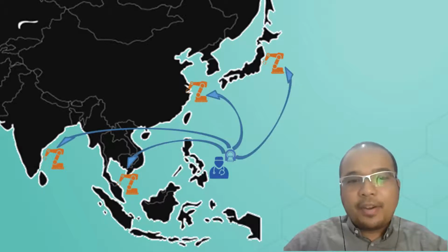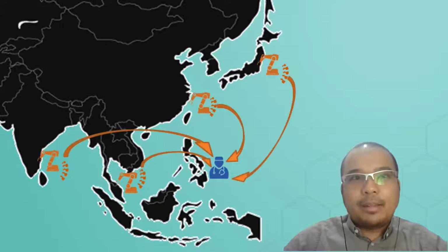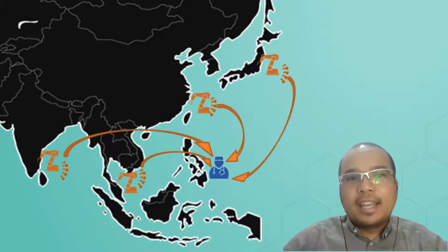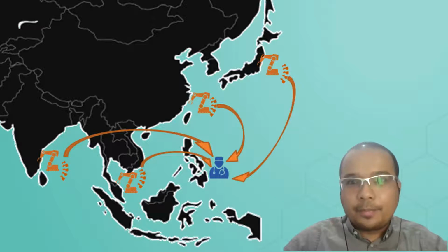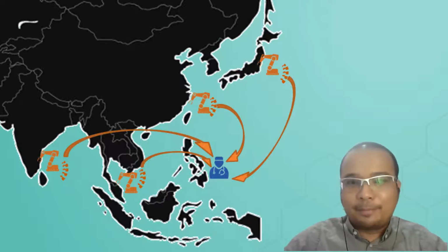And then the fabricator will make the anatomical model based from your DICOM file and physically send the model to the doctor. Now, considering this a logistics setup, it will really take time.